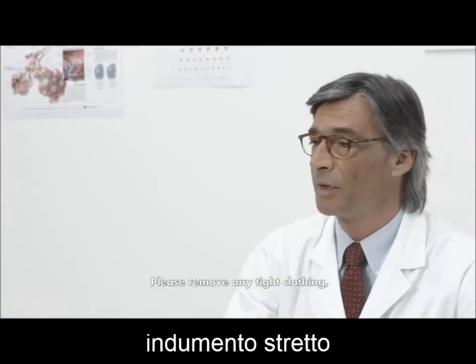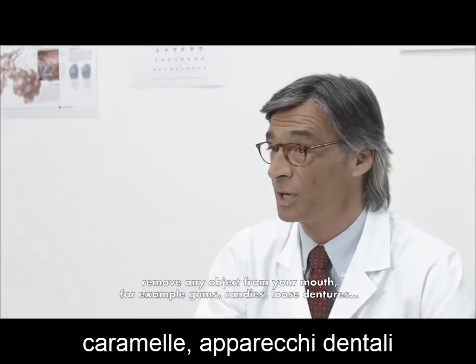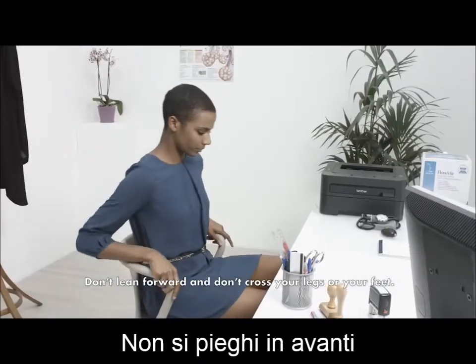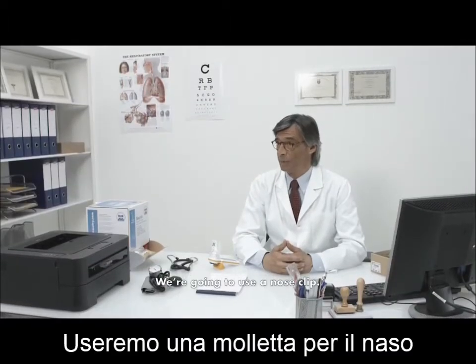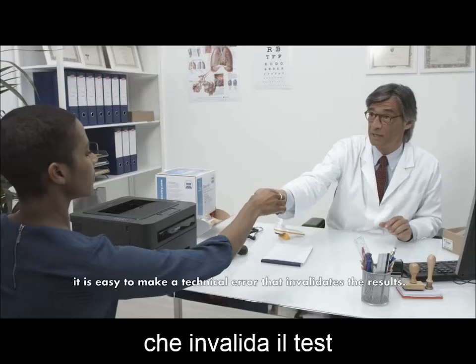Please remove any tight clothing and remove any object from your mouth — for example, gum, candies, or loose dentures. It is preferable to perform the test in a seated upright position. Don't lean forward and don't cross your legs or feet. We are going to use a nose clip. If the nostrils are not blocked, it is easy to make a technical error that invalidates the results.